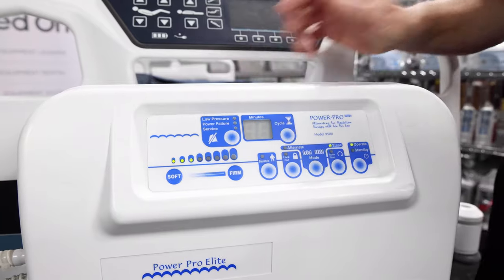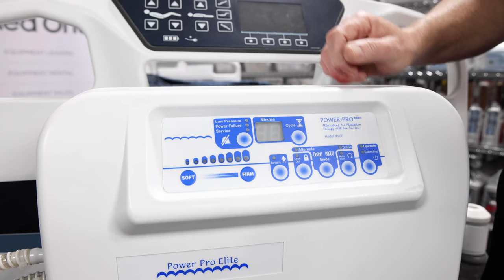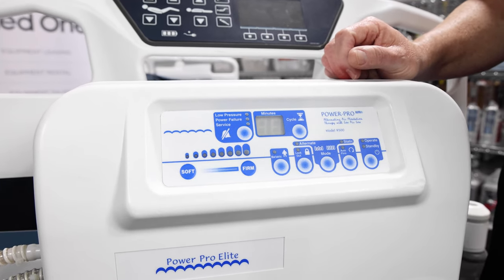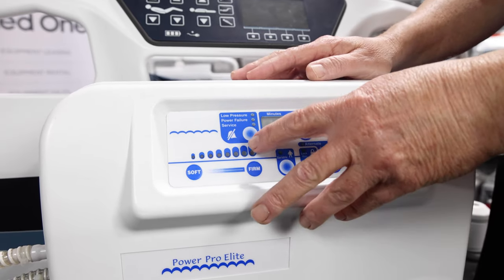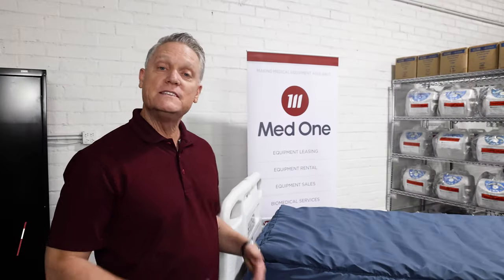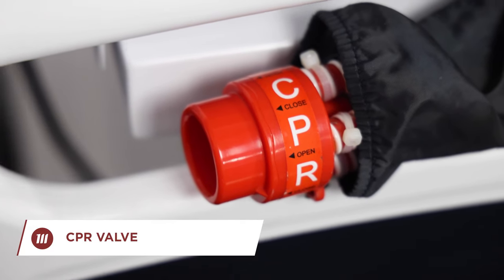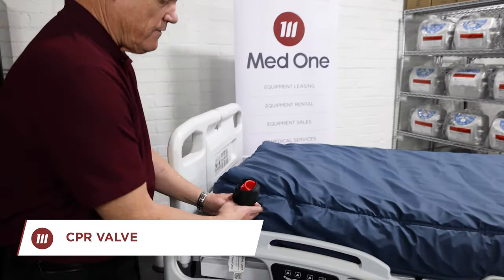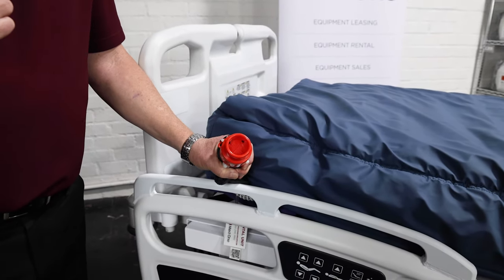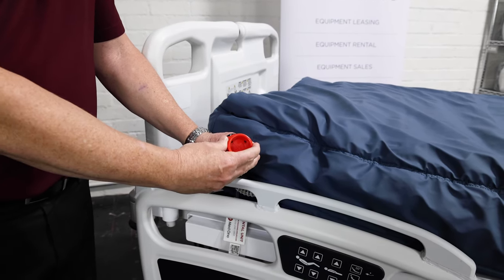I will now demonstrate for you a power failure. If you lose power, immediately a power indicator light will begin to flash under power failure with a chime. You'll need to check your electrical cord, but you can also silence the alarm so it does not continue to beep. In a CPR situation, locate the CPR valve at the top of the mattress on the patient's right side. Get the valve and turn it one click to the right to release the air. Turn off your control unit. Once you've resuscitated your patient, close the valve by another simple twist.